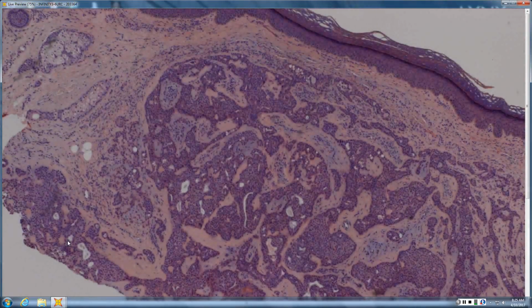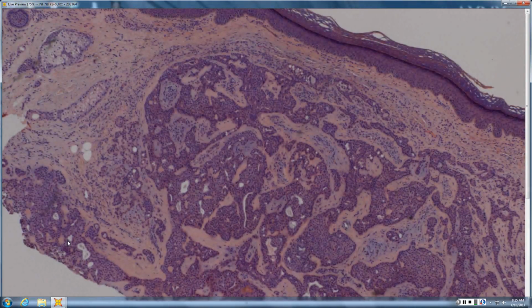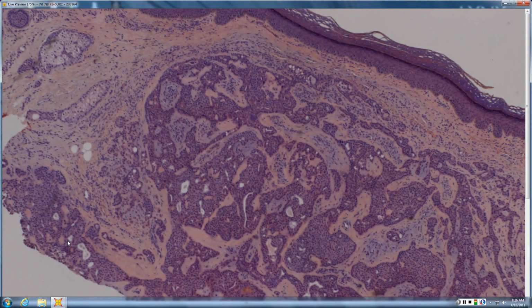So definitely, I'm kind of in the acrospiroma group because they're not blue, they're kind of pink and blue. Acrospiromas usually, is it an anastomosing pattern? Not as much, with bluish stroma in between? Oh, it's a mixed tumor. Mixed tumor, you got it, exactly. So, you went right to benign adnexal sweat gland, which is absolutely correct. It's anastomosing with bluish hue to the stroma in between. That's a mixed tumor.